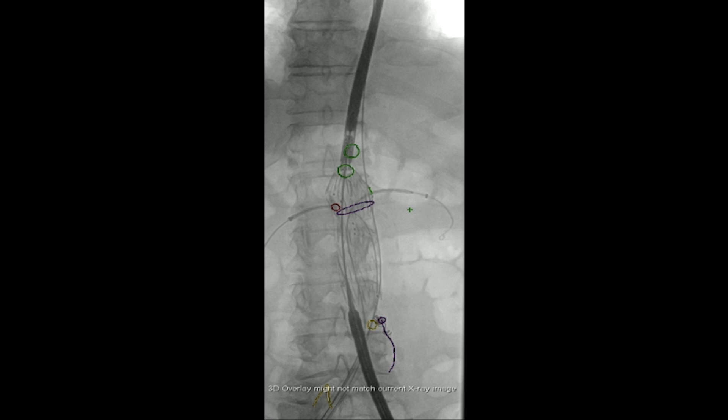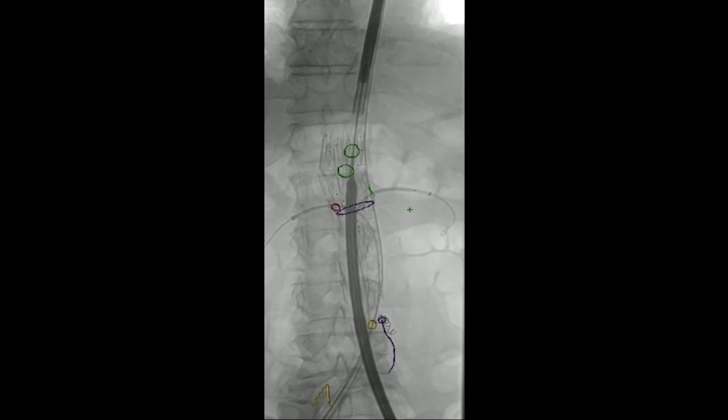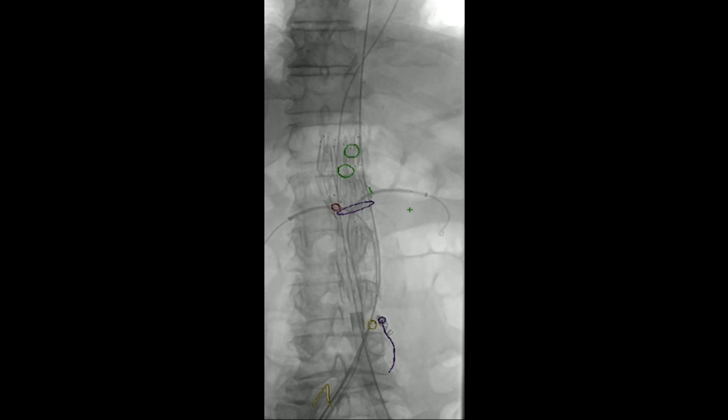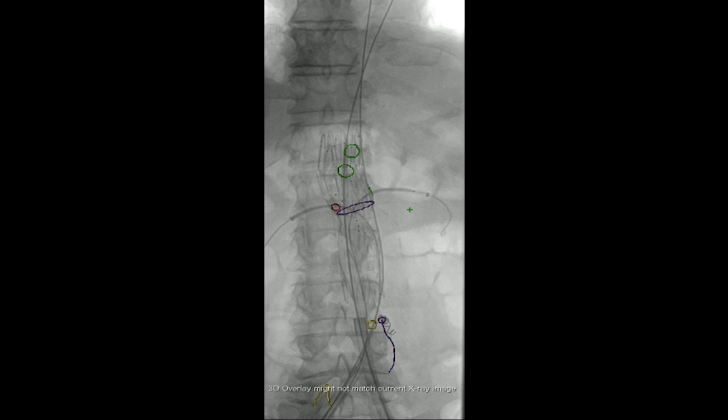The apex of the fenestration is being deployed. We advance the nose cone, and the supra-renal stents are deployed and in position. We can now dock the delivery system into the nose cone, which gives a nice transition, and then remove the entire delivery system. This is the one chance to balloon the aorta, because once these VBXs are deployed you won't be able to do that. So we almost always take that opportunity — a Coda balloon is brought up into place. The VBXs are still protected inside the Ansel sheaths as we dilate the fabric of the neck.